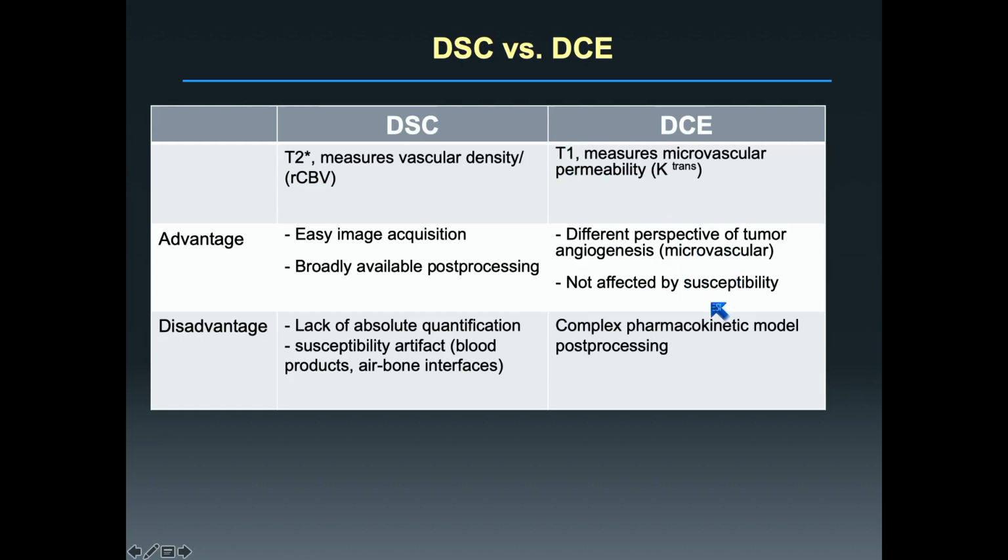The disadvantage is the relatively complex pharmacokinetic model post-processing, but again, that has been, I think, addressed with most of the software packages that are available these days. So they are relatively seamless in terms of post-processing at this point.